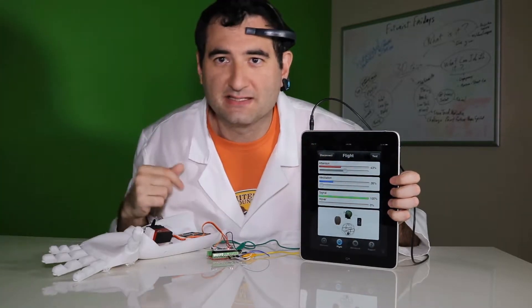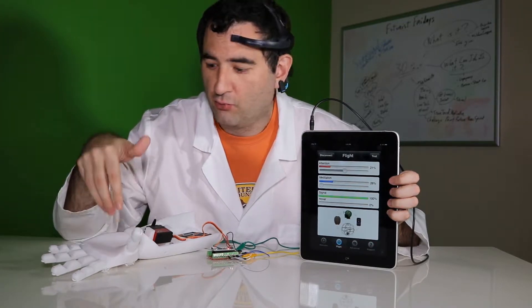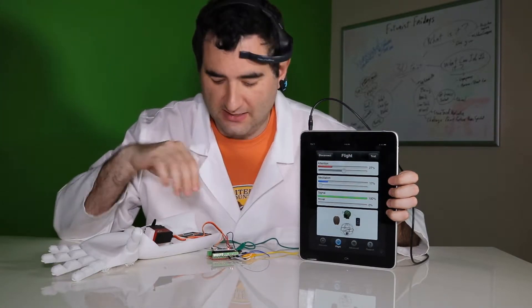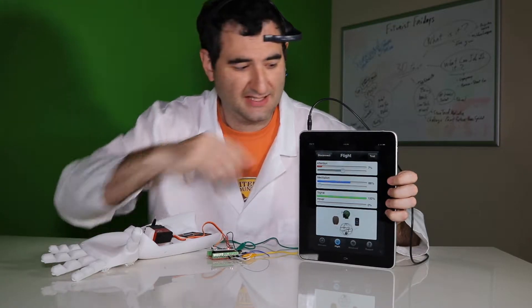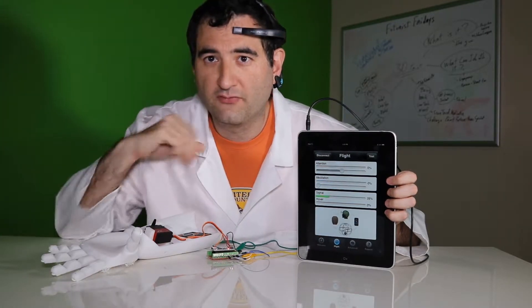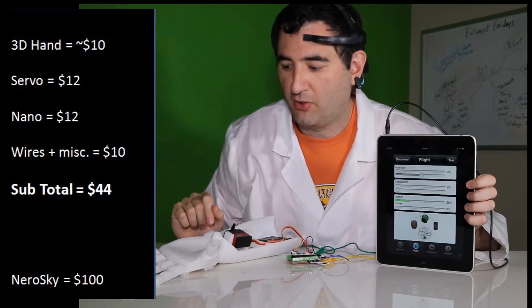This is amazing stuff, guys. This is a $50 robotic hand with all this electronics already. All this stuff that's on this table, besides the iPad and the Neurosky, we're under $50. Let's look over here and I'll show you the list of the components that we bought.